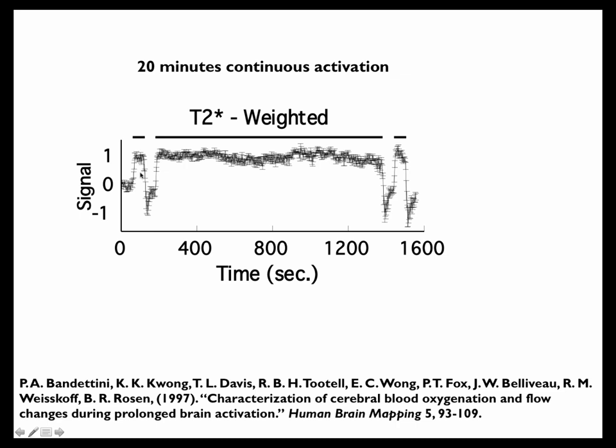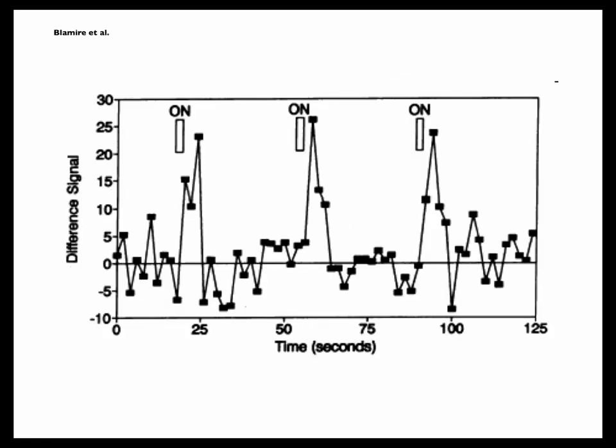And it actually seems that as long as you keep the brain going, the signal stays up. This is an experiment where we basically tortured our subjects. We did 20 minutes of continuous visual stimulation flanked by two 1-minute stimulations just to correct the baseline. Basically, the BOLD signal stays up the entire time. So it's very clear that the hemodynamic coupling is high fidelity, related to ongoing neural activation.